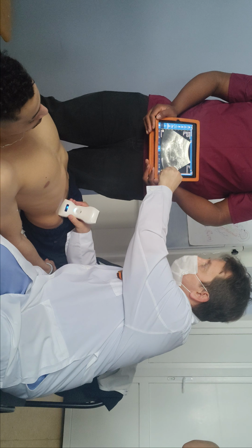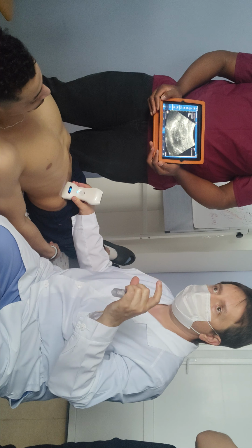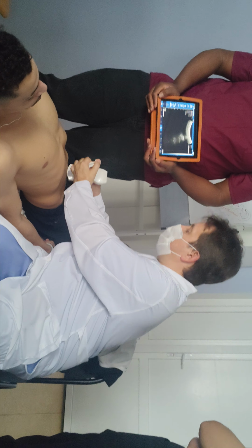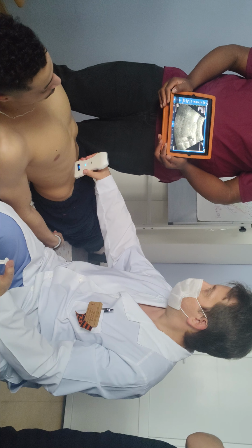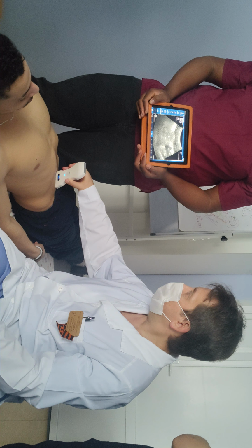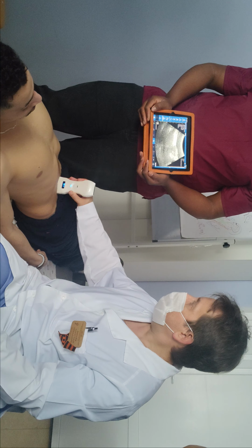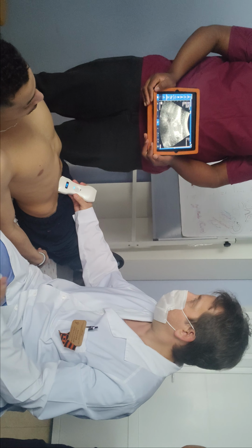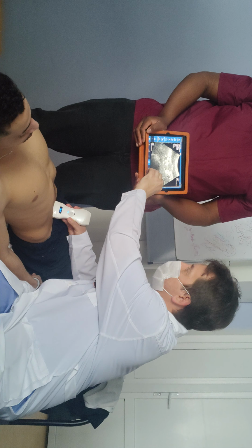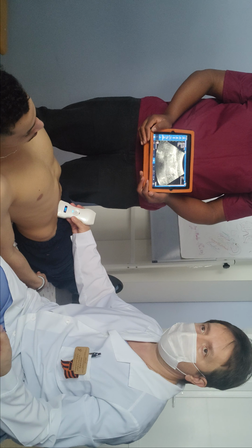And again, between this line and the internal organs, in a case of a surgical emergency, we must have the space filled with water. It is a black space. Next, we transfer to the umbilical, to the bladder zone. I must remember that in some cases we cannot see a big bladder. Here it is, that black rounded shape. It is a bladder, and it means that no other liquid is nearby.